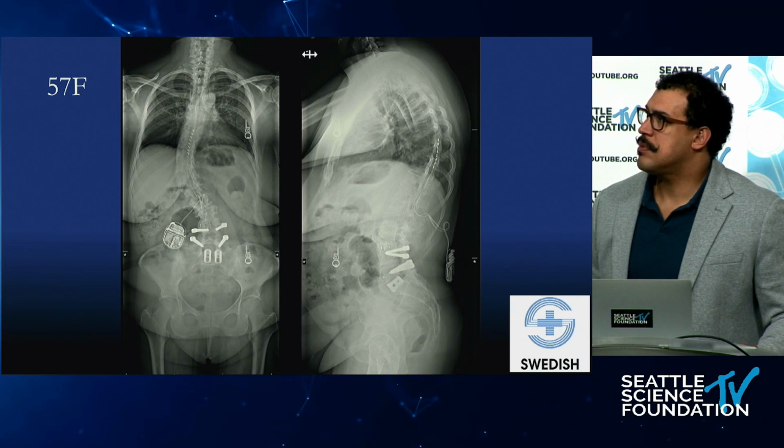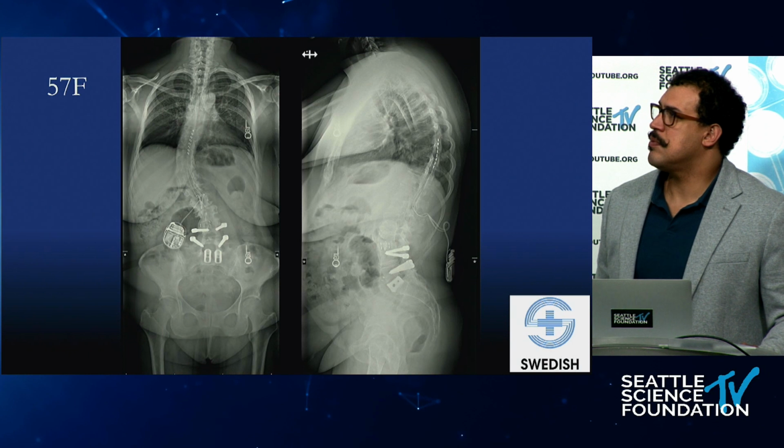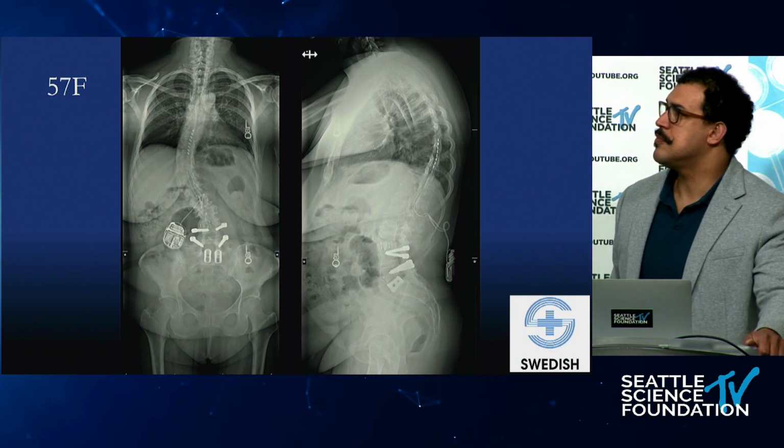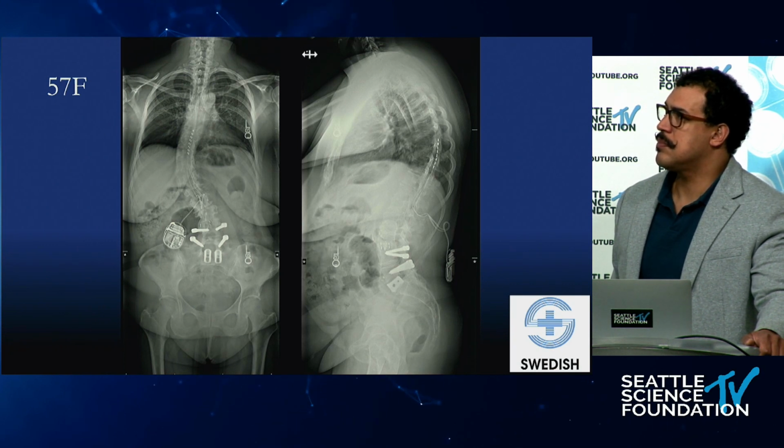But in the modern 3D printed porous titanium era, this is becoming a meaningful part of my practice. It's still a very small percentage with a very targeted patient population. But I think the technology has caught up with the vision of the early adopters from 15 years ago. And our current technology actually allows us to address cases just like this with standalone laterals in very specific instances.